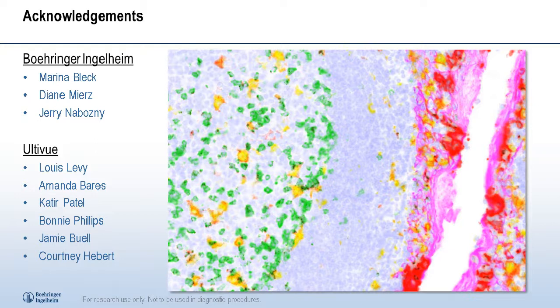Great, thank you. Someone here missed a point. They say, is it only fluorescence or is it also chromogenic? This is a fluorescence technology. The probes are labeled with fluors. The barcode-specific probes are labeled with fluors.